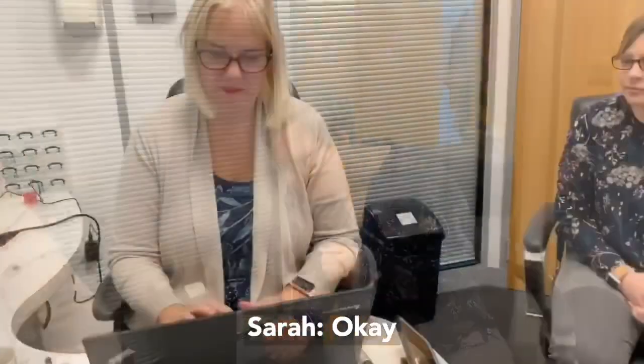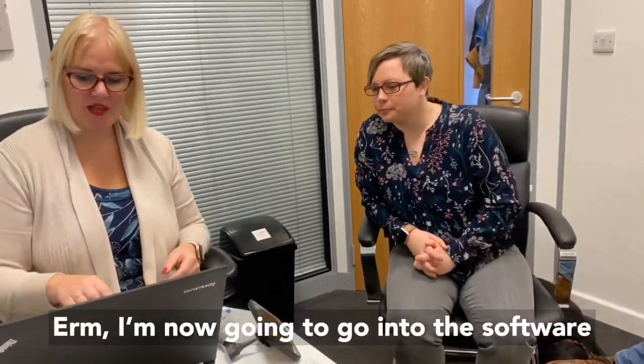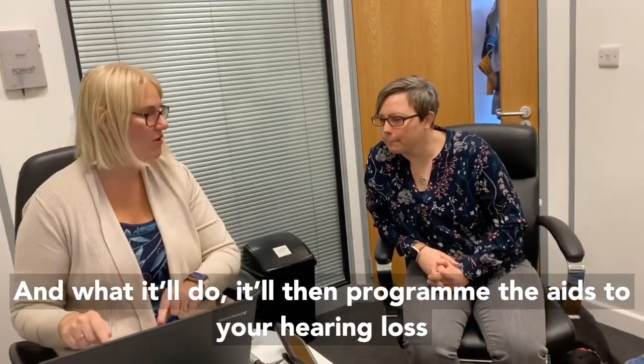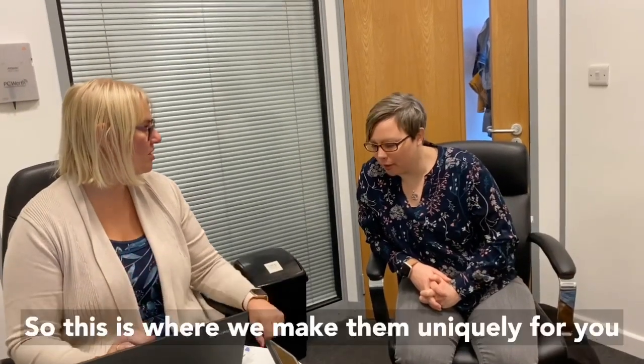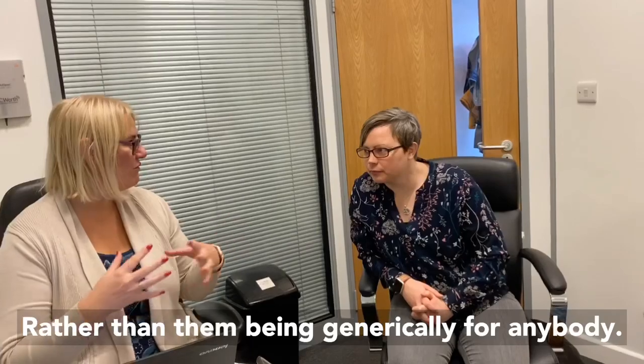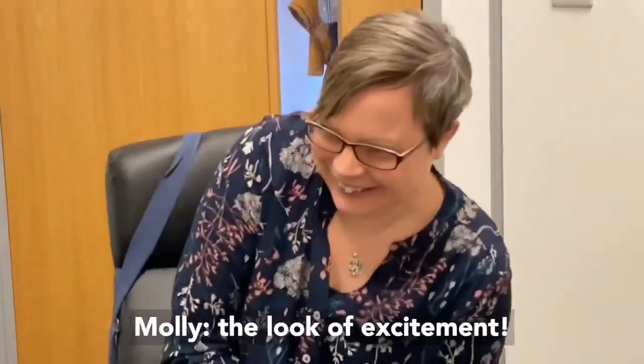Wow. Okay. What we're going to do now, the hearing test results that I've got, I'm now going to go into the software, and what it will do is it'll then program the aids to your hearing loss. Because obviously everyone's got a different audiogram. So this is where we make them uniquely for you, rather than being generically for anybody. Yeah. All right? We're excited.